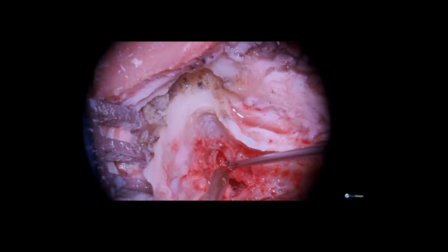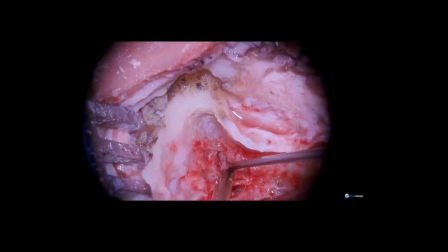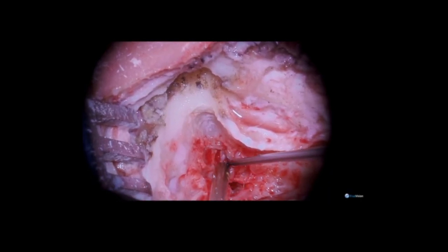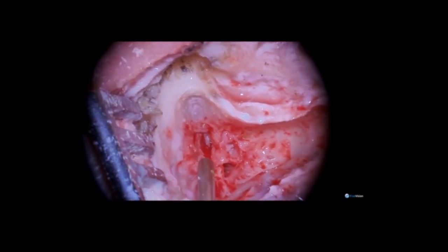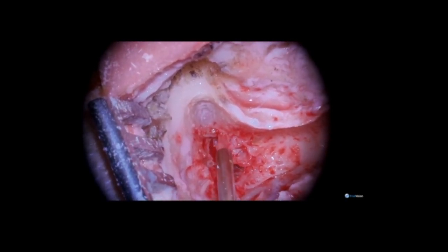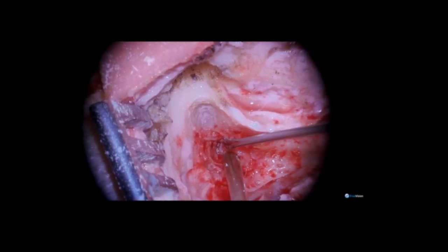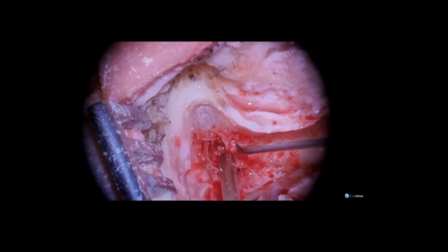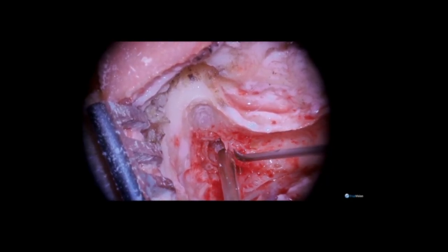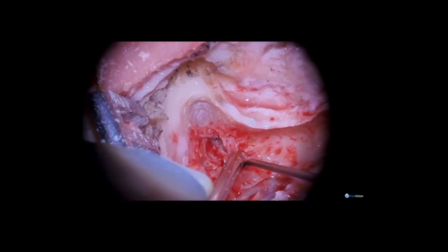It is very important when dissecting the matrix to try to preserve it and keep it intact so that you can follow it as a tract to not leave any residual portions. The epitympanic region still requires further dissection, but I will do this in stages and follow the matrix so as not to disrupt it, carefully dissecting it free from its bony attachments.